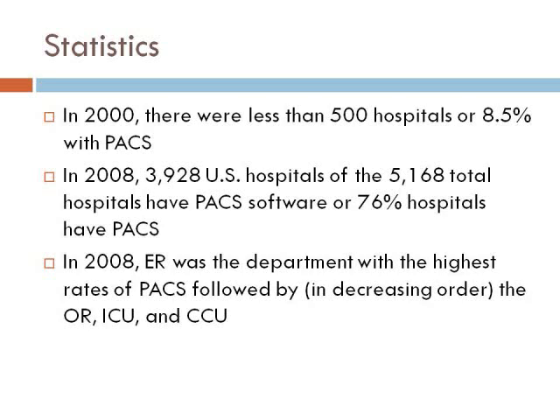Typically, the area in the hospital that uses PACS the most is the emergency room department, which has the highest rates of PACS, followed by the operating room, the intensive care unit, and the critical care unit. So there's definitely a need, it seems, for PACS within the ER.